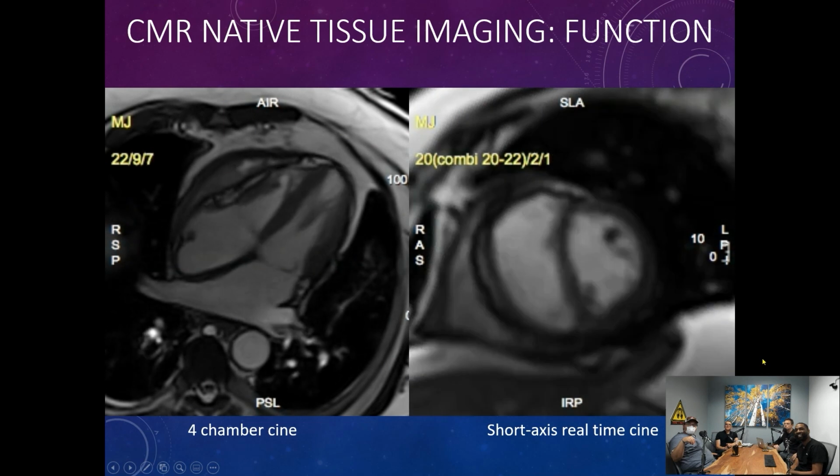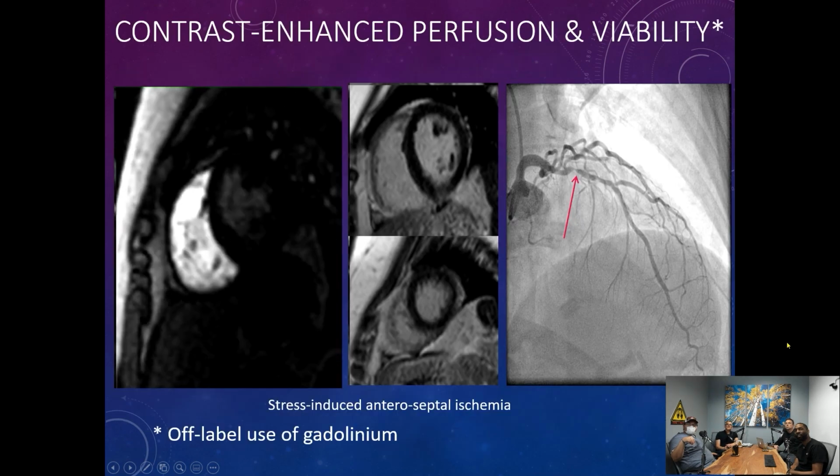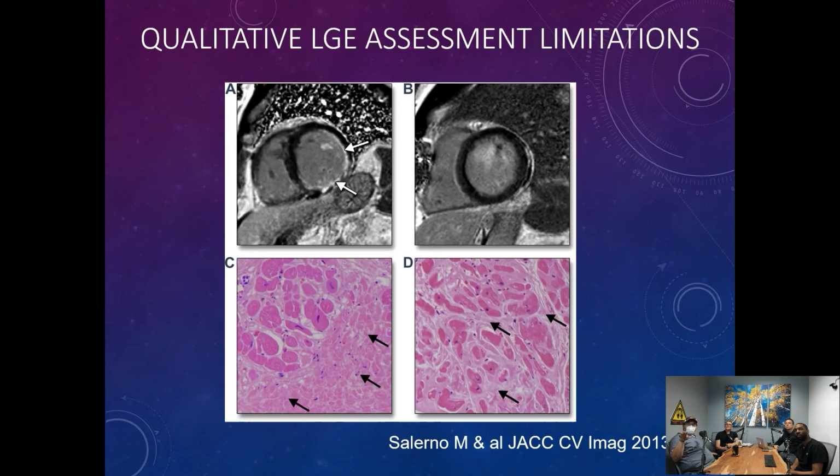Well, now here's an important distinction. The heart enhances. Okay. Do we have some delayeds in here, I think? There might be. I don't know. They might be further down. Here we go. Next one, I think, has the delayeds. Nice. So you can see those white areas there.